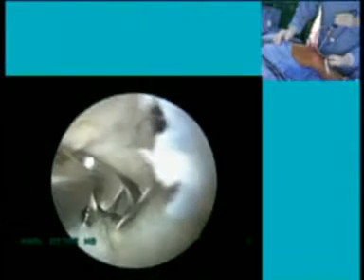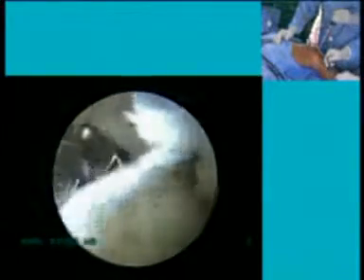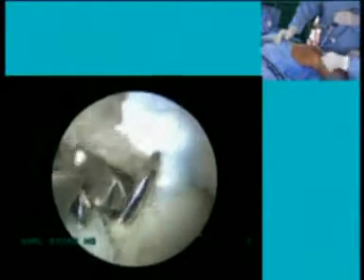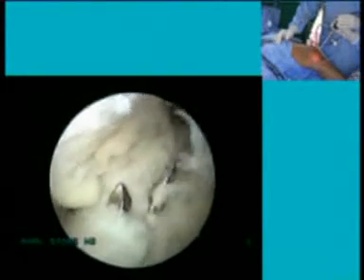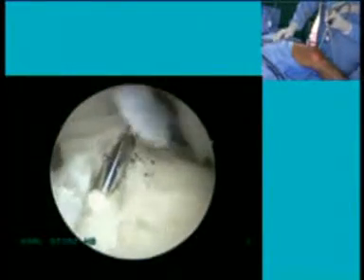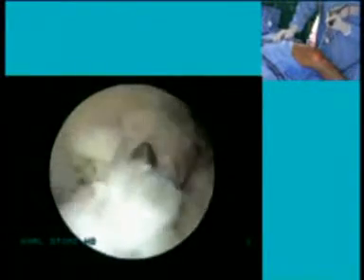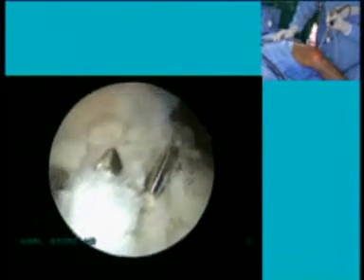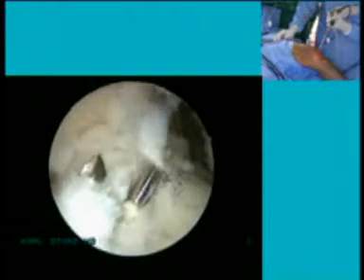So for the benefit of the audience, the PL tibial tunnel would be more posterior than the AM. Dr. Wolf, you're happy with this guide wire for the PL tunnel? It looks a little more anterior than what it should be, isn't it? Yes, but I prefer not to change the position of the guide wire. I get a feeling that these tunnels might collide if you ream them. Do you get the same feeling? Yes, but in most cases we have a confluence of the tunnels, because the tibial insertion is much more narrow.